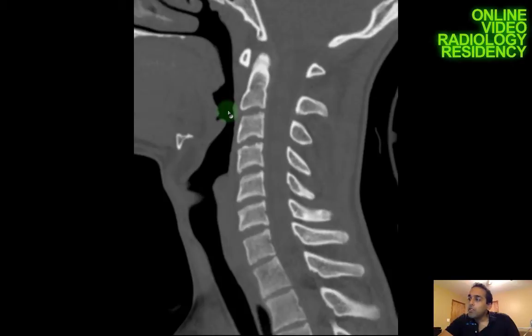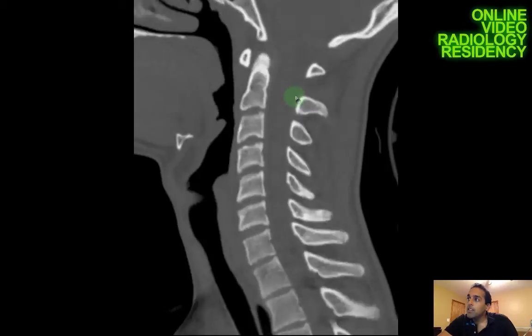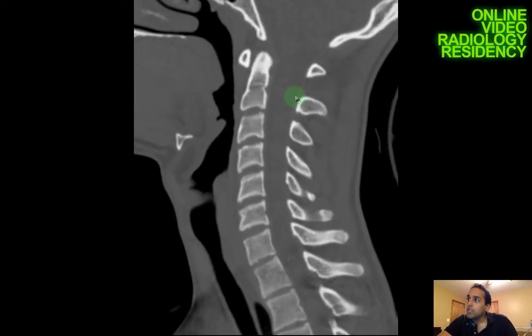Let me show you how I start off looking at this study. They say to use the sagittal set of images — that's really the workhorse of the study, and it's where you get the most information initially. Coming into the midline sagittal view, you can see the long axis of the cervical spine.